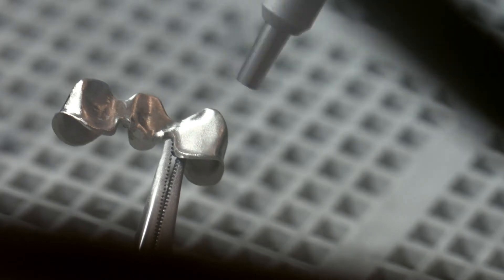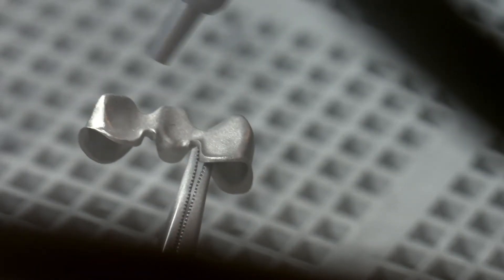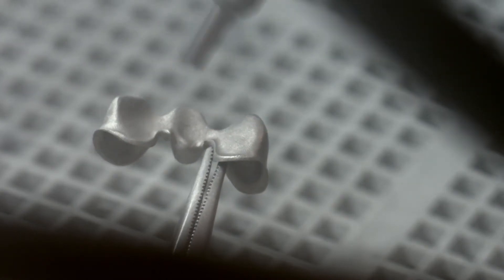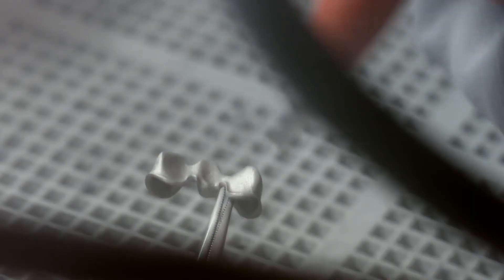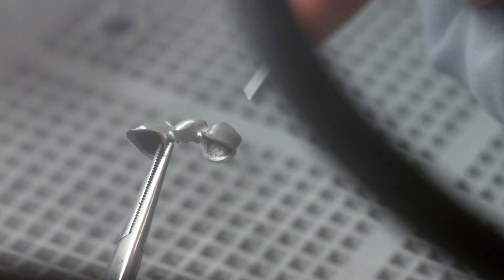Carefully blast the framework with aluminum oxide after finishing. The strength of the blasting pressure depends on the hardness of your framework alloy. The enlarged surface and micro-retentive areas produced by the blasting process enhance the mechanical bond of the ceramic to the metal framework and therefore the quality of the restoration.